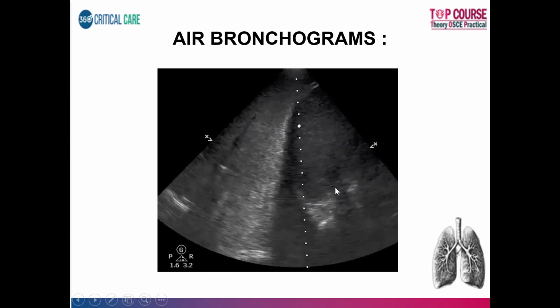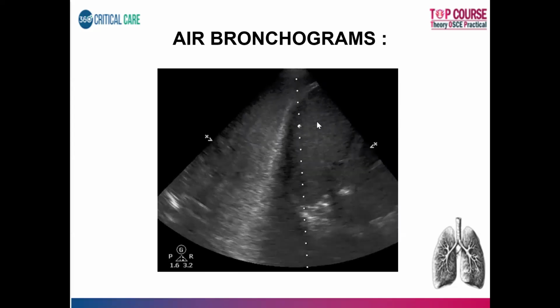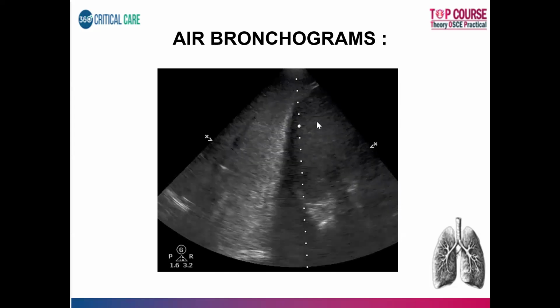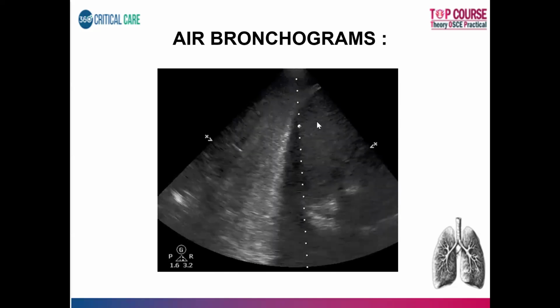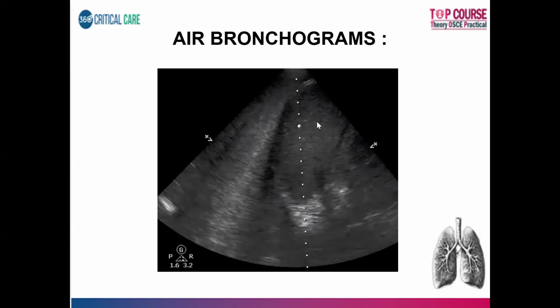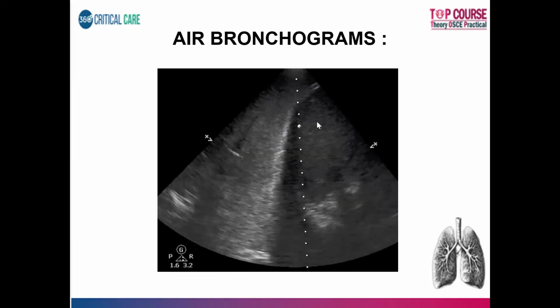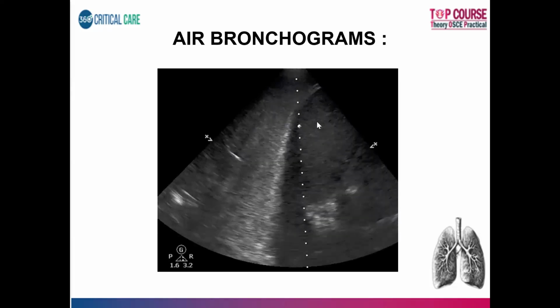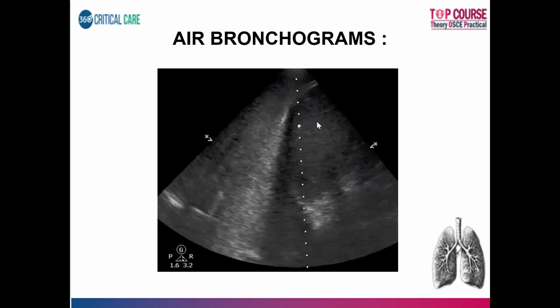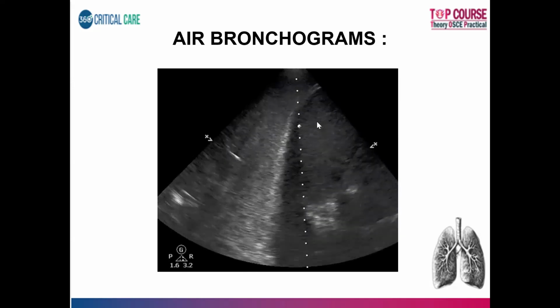So what type of air bronchogram is usually seen in static? What is the pathology with a static air bronchogram? Collapse. Collapse, that's atelectasis, right. Okay, good. So, do you know the types of dynamic air bronchogram? There are two: a linear air bronchogram and a dot-like air bronchogram, both dynamic air bronchograms. You just need to remember that. Nothing great in knowing them.